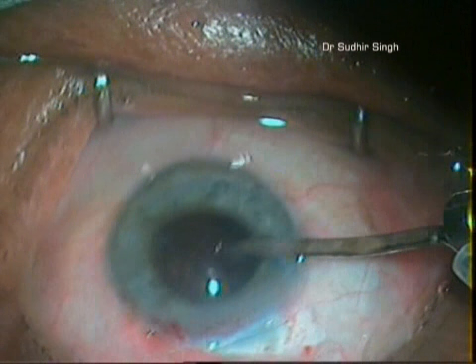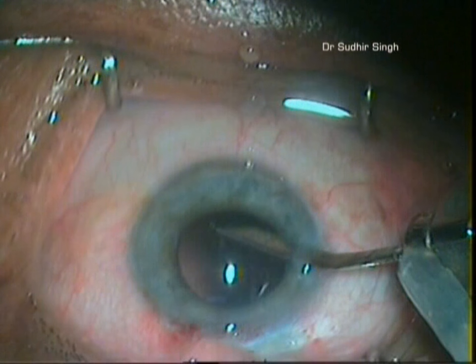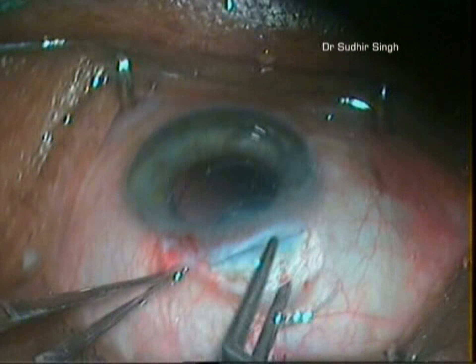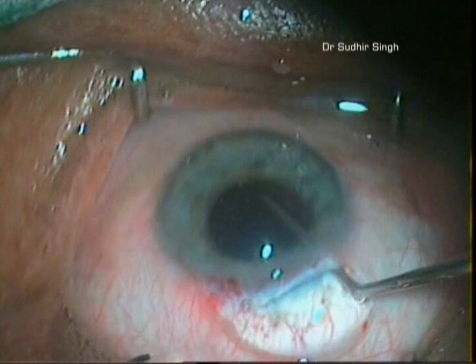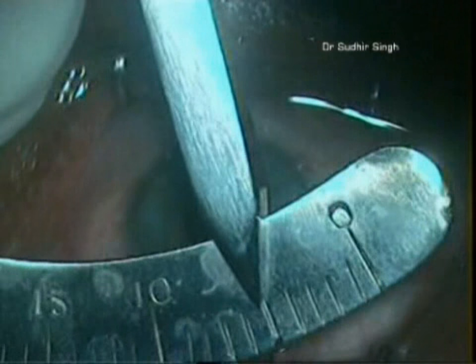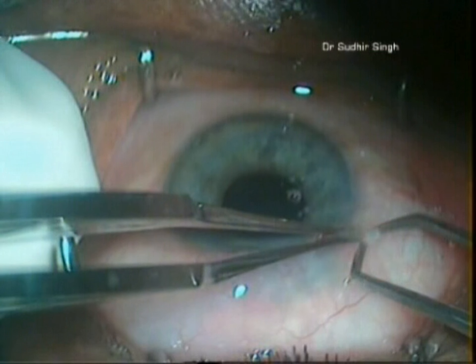The remaining nucleus part and cortical matter is flushed out by hydrojet. A single-piece PMMA intraocular lens is implanted into the capsular bag. On the first post-operative day, the cornea is bright and clear with 20/20 vision unaided.